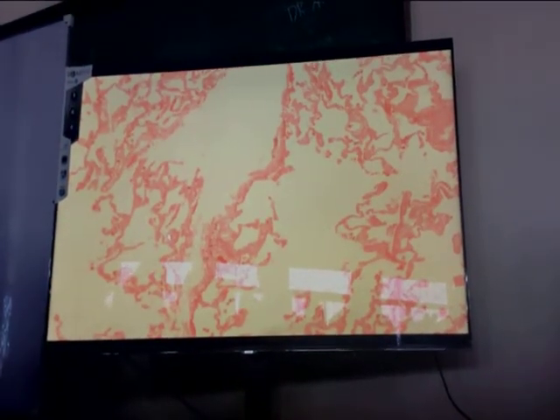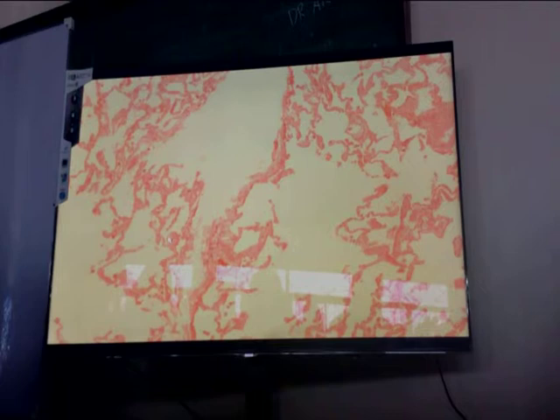The stain is very faint already. What is the diagnosis for 219, please? ARDS. Okay, ARDS. Now, ARDS is not a specific disease entity as what you have studied in the lecture. So, hindi siya specific disease entity, but an outcome of severe lung disease.